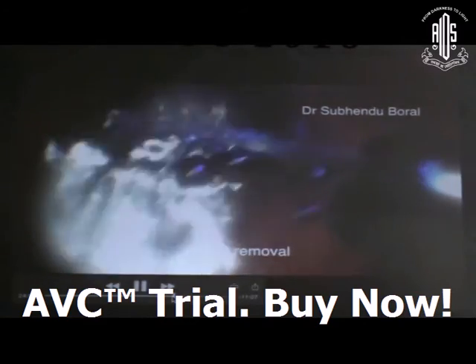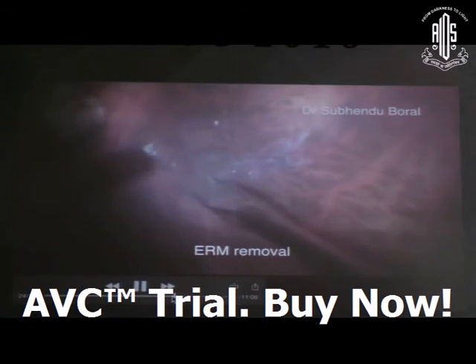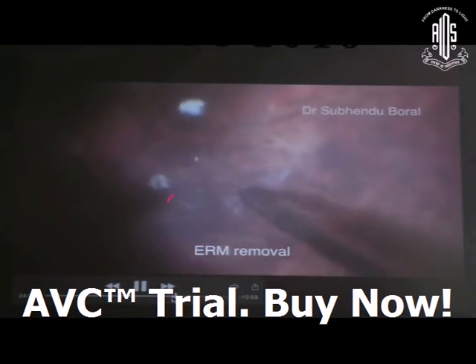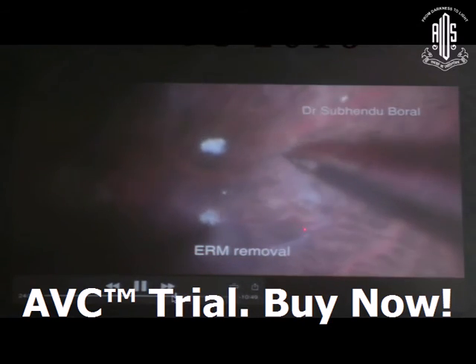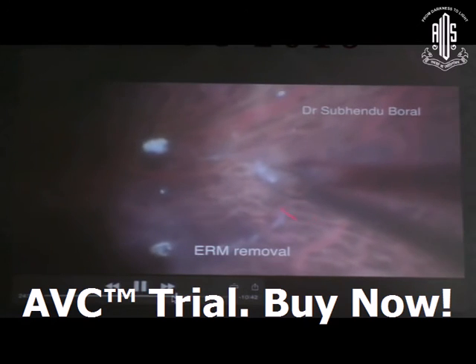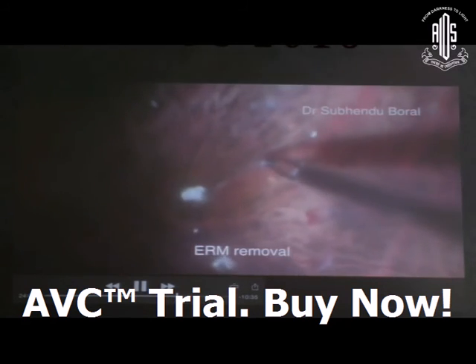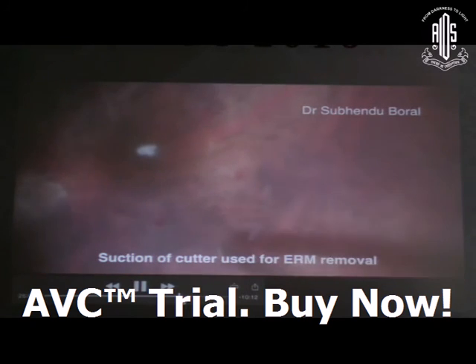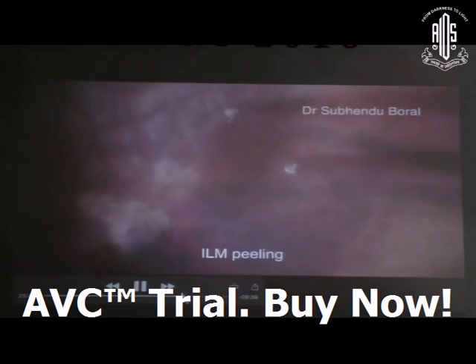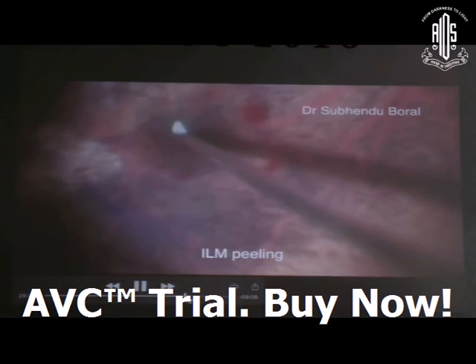In retinoschisis, there is splitting of all retinal layers — inner and outer nuclear layers will be split. Anterior to the internal surface, all taut structures and membranes must be removed. Stain the ERM with trypan blue, stain with triamcinolone, and remove the taut posterior structures. Then peel the ILM with BBG dye. ILM peeling is very necessary, and recent reports are all showing that ILM peeling is mandatory for retinoschisis cases.